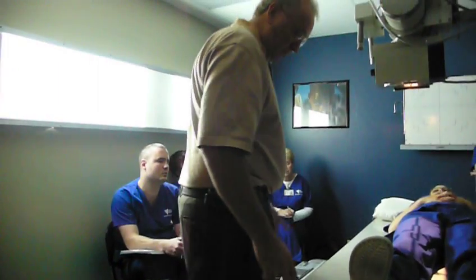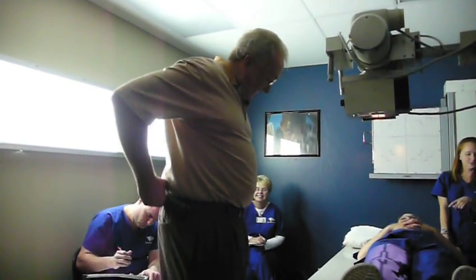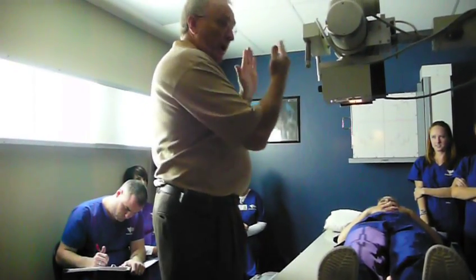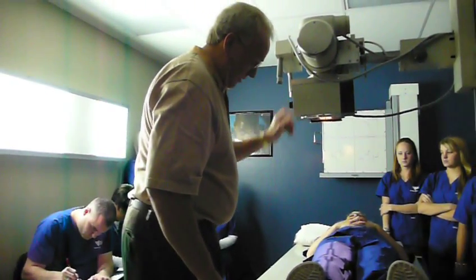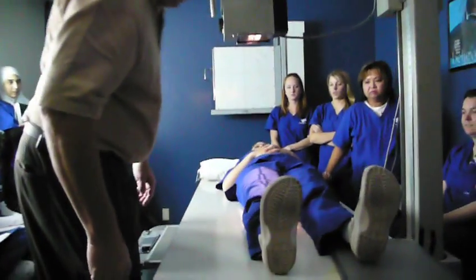What did I forget to do? Put my marker on. That's eight points? Eight points? You're going sharp today. I collimated width-wise as much as I could. I have to watch out here to make sure that I still get soft tissue.